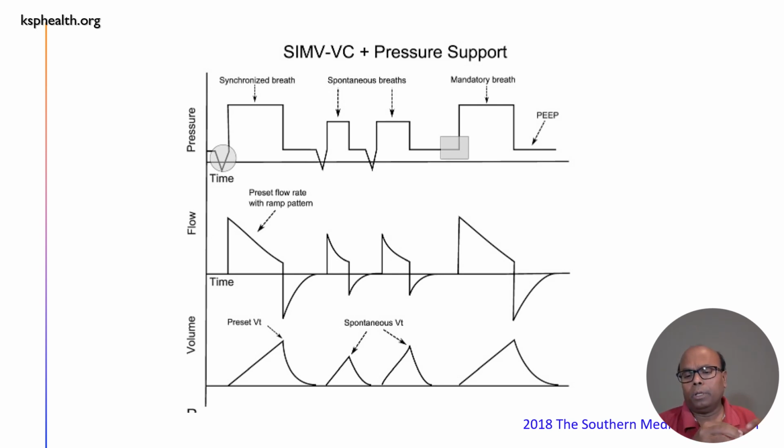This mode is helpful in preparing the patient for weaning, and it also helps with patient ventilator dyssynchrony or asynchrony. It really helps. It reduces the level of sedation exposure. So definitely it is much better than the intermittent or continuous ventilatory modes we have discussed before.